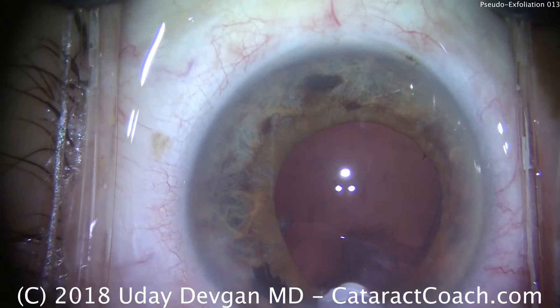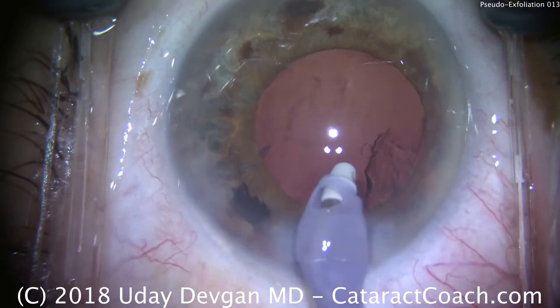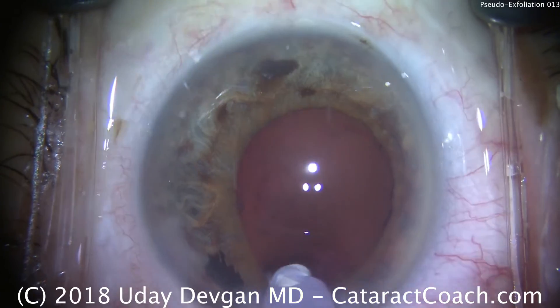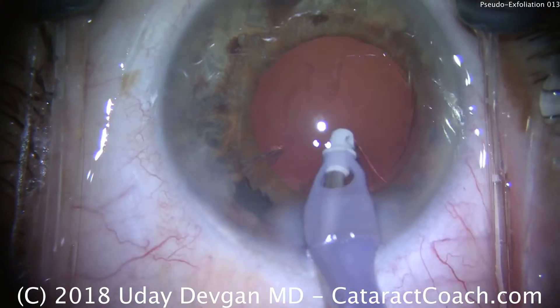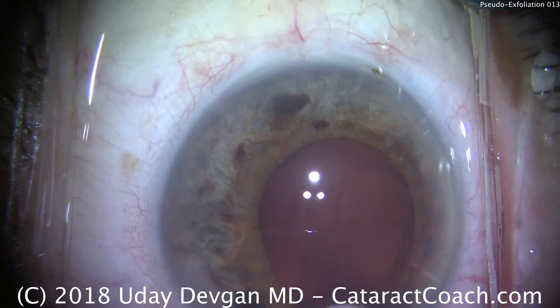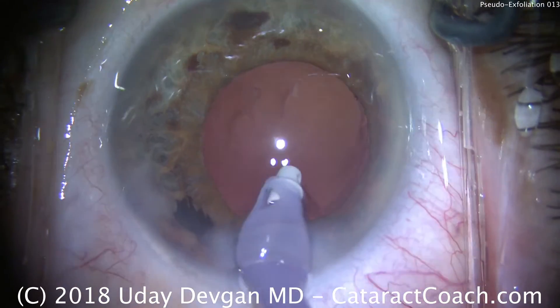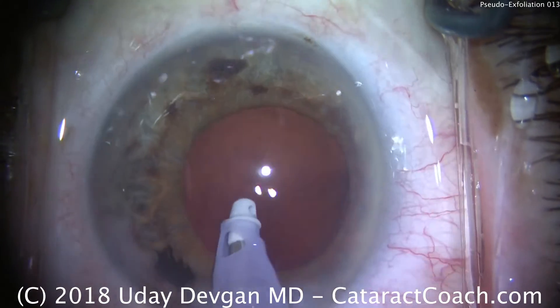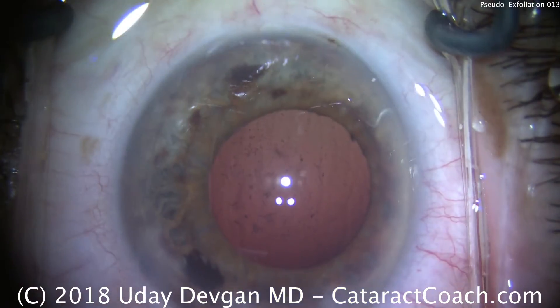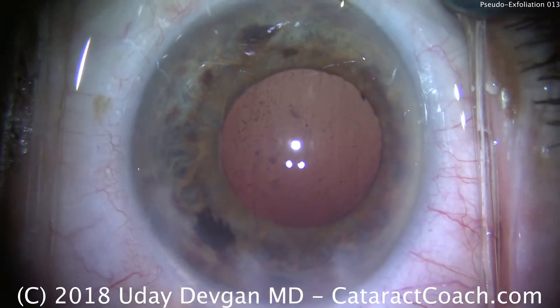We've removed it. Stringy material on the posterior capsule could be gently vacuumed, but in this case we want to do no harm. We've got to be very careful in making sure that the capsule and the capsulorhexis don't move and that the zonules are not being broken. We can always do a YAG laser capsulotomy if we need to.